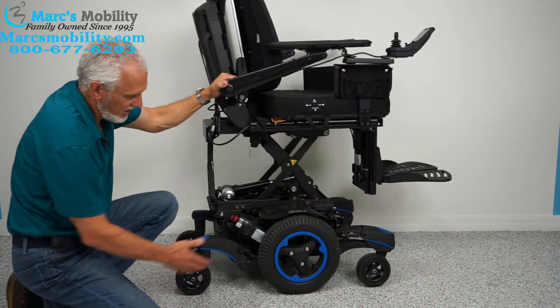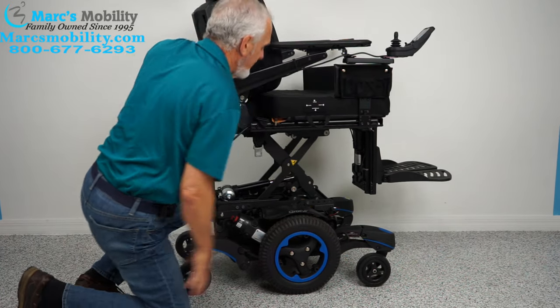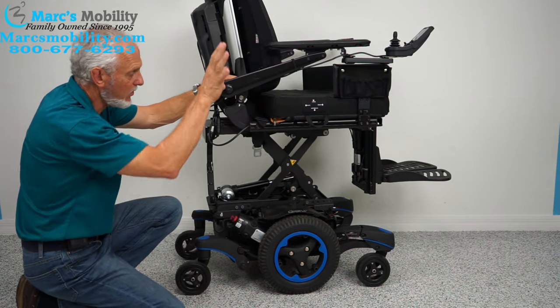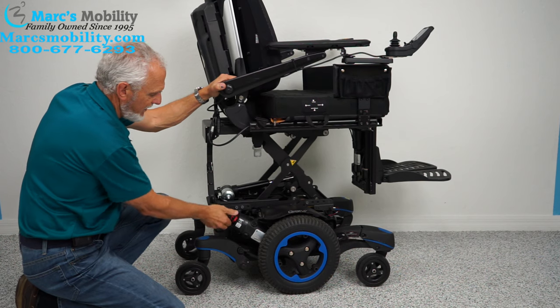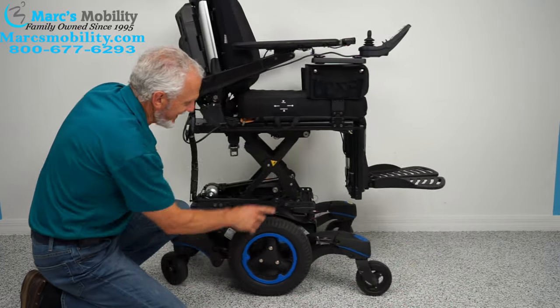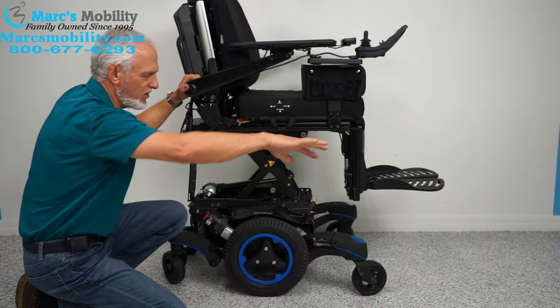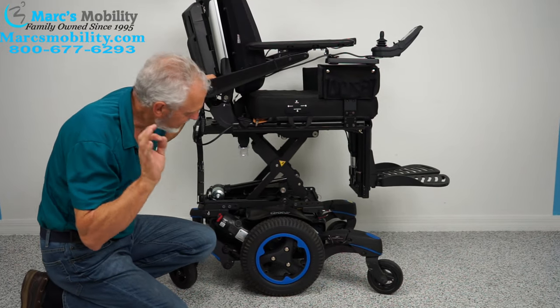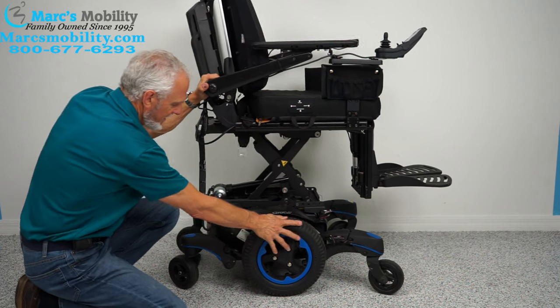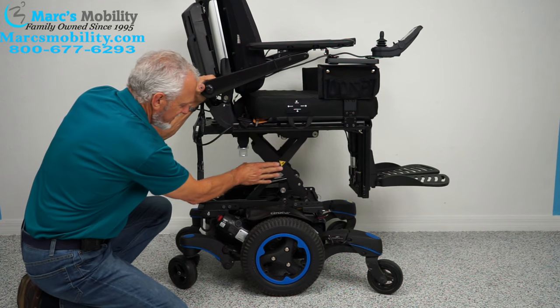There is a motor for each drive wheel. When the chair is in gear you can't push it, so turn the power off first to remove motor resistance. In the back there's a red handle — turn it down to unlock the wheel. Do both sides, and then you can roll the chair. When you're done, don't forget to put both motors back in gear; you'll hear a click when it's engaged.